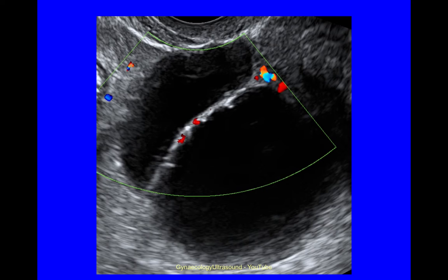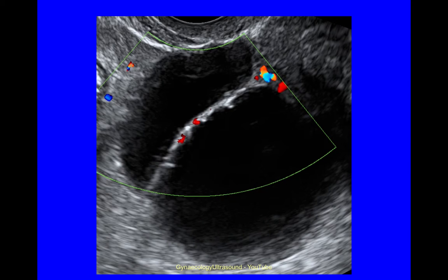Again, a multilocular cyst with no solid material. There are some slight irregularities on the septum, but their height is less than 3mm so they do not count as solid material — they represent an irregular internal wall instead. Anechoic cyst contents, minor vascularity with a score of 2, and no shadowing behind the cyst.